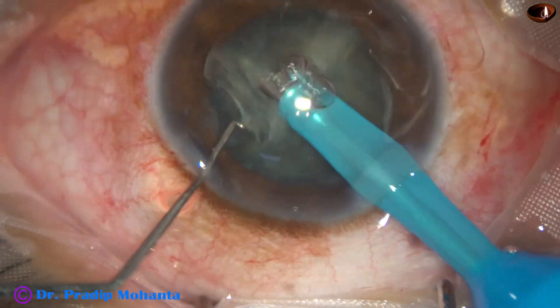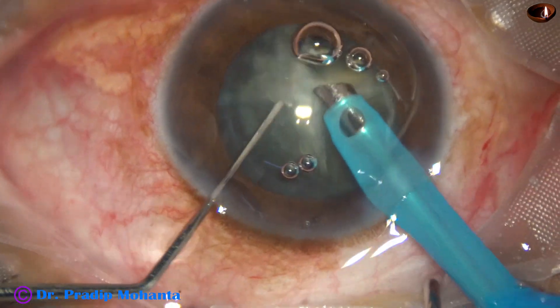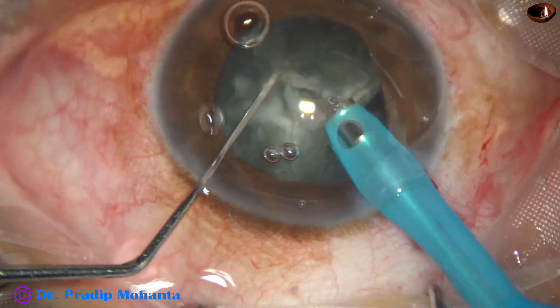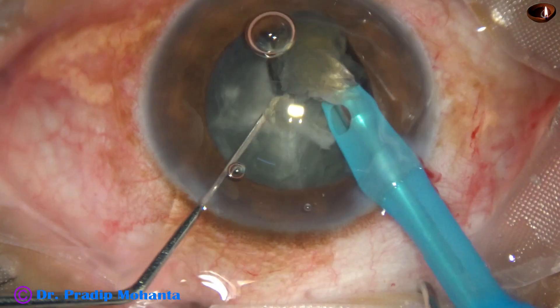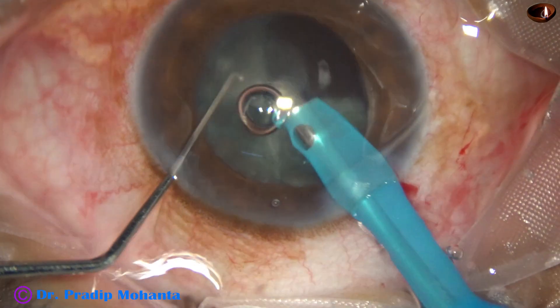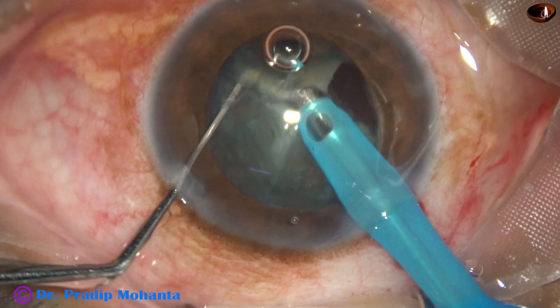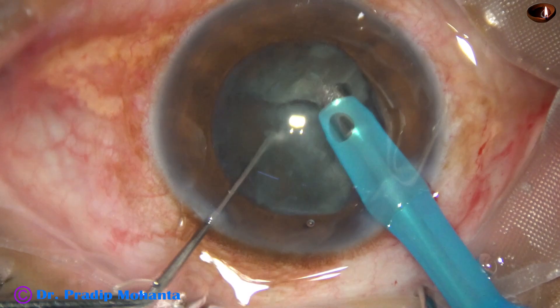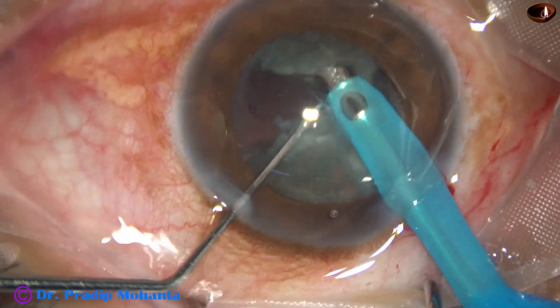And now we go into the anterior chamber and start emulsifying the pieces. Ultrasonic energy is set at 60%, flow rate is 45 ml per minute, vacuum is 450 mmHg. This is the Faros from Oertli's Cataract line.